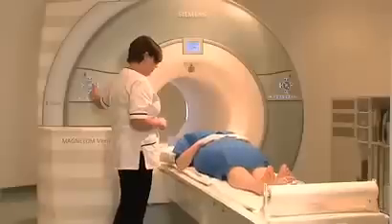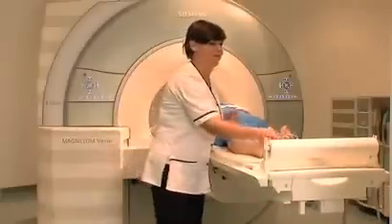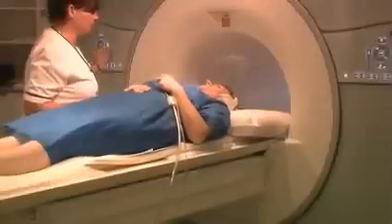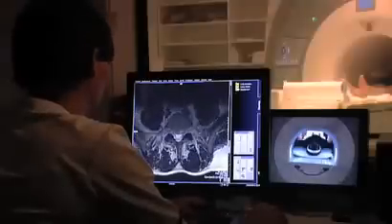The part of the patient to be scanned is placed in the machine. During the scan, the machine can make very loud noises, caused by the magnets rotating within the machine. Headphones allow the patient to listen to the radio or music — you can even bring your own CD. The radiographer will monitor you throughout the scan.